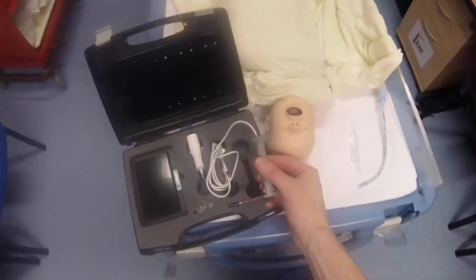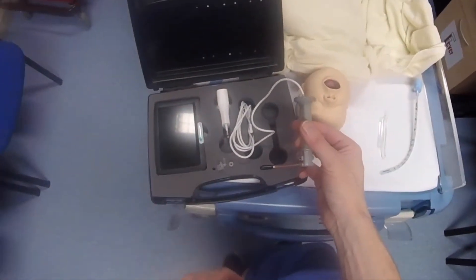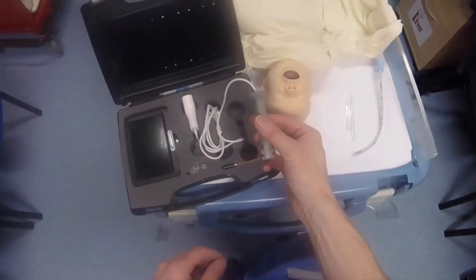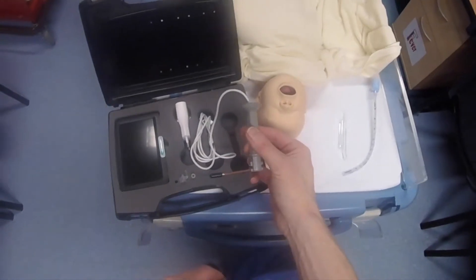Today I want to give you a quick demo of the PEEK VN Videolaryngoscope by PEEK Medical. This device is mainly geared at the neonatal market. It comes in a range of sizes — I've got the Miller 1 size here, but it goes all the way down to 00-0 for preterm neonates.